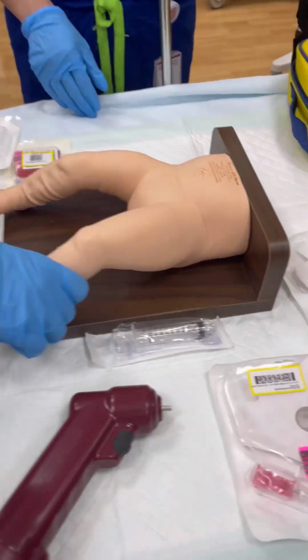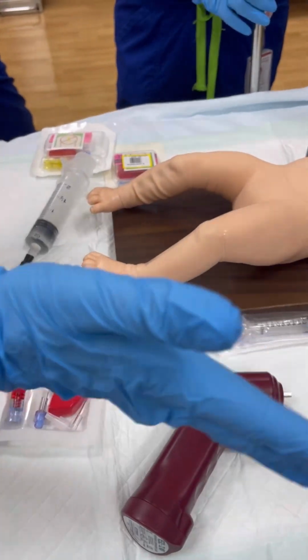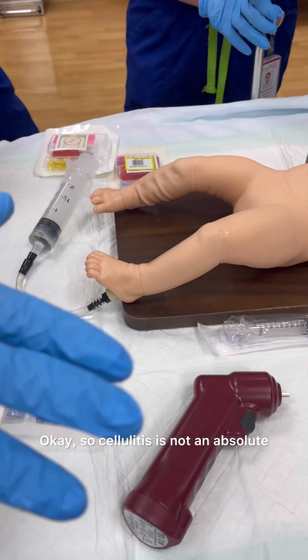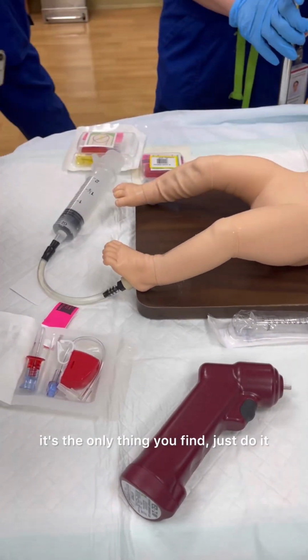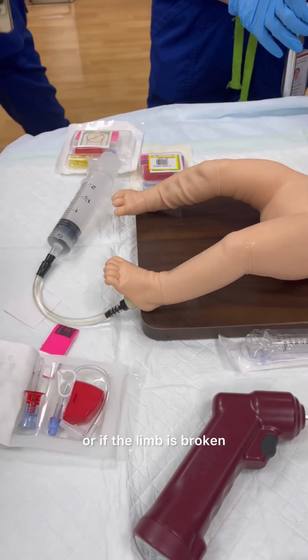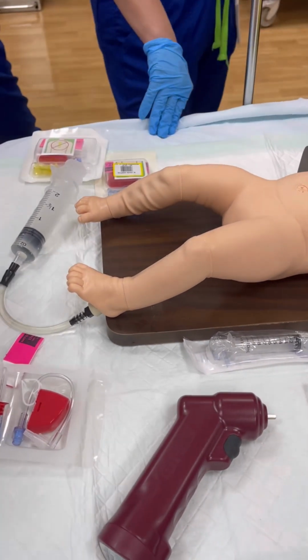A fracture. If there is a fracture, you cannot place it there. Go to another site. This is the only absolute, or if the limb is amputated. Everything else you can argue about. Cellulitis is not absolute. It's relative, so it's better not to, but if you have no choice and it's the only site you find, just do it. The only absolutes are if the limb is gone, amputated, or if the limb is broken. Understood so far? Any questions, Sarah?